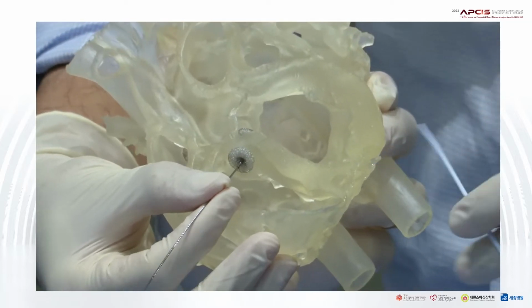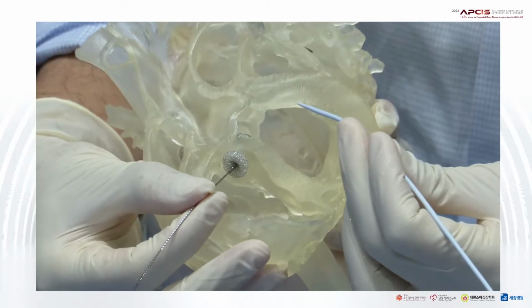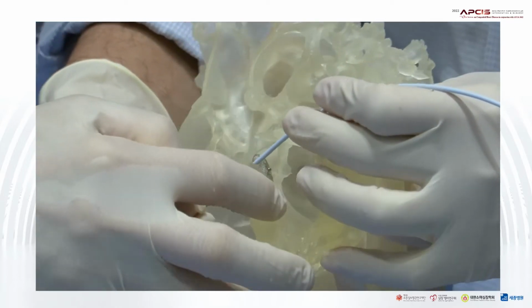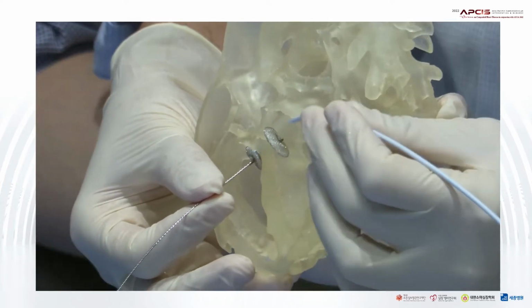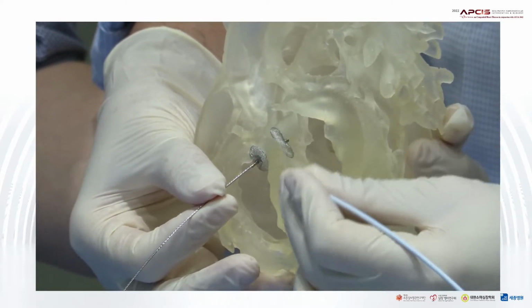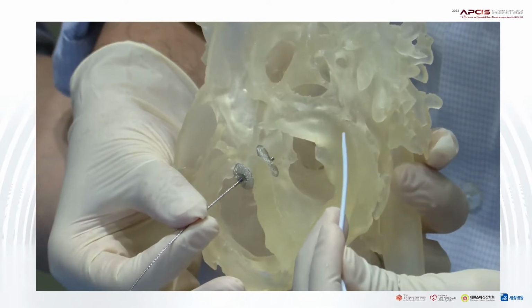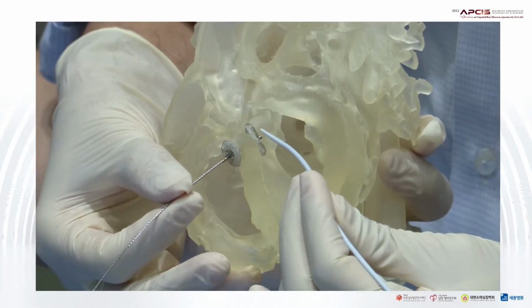So in general, when you put the device in, we need to pay attention to at least a couple of things. First one is touching of the device to the aortic valve. Second, the touching of the device to the conduction system. The third is touching of the device to the tricuspid valve. And last but not least, in small children or small babies, when you put the device here, you may have an issue of left ventricular outflow tract obstruction by the device, right? So these are the things that by angio and echo, you need to make sure before you release the device.